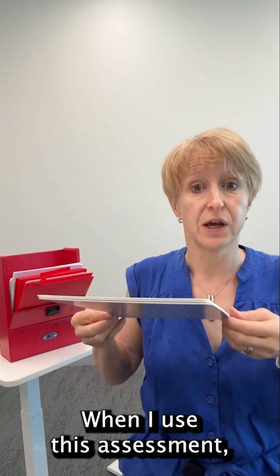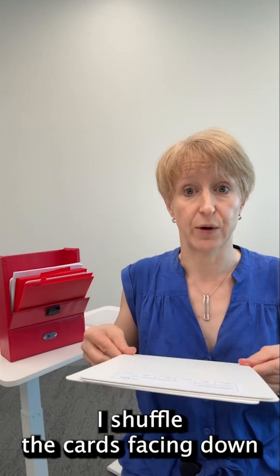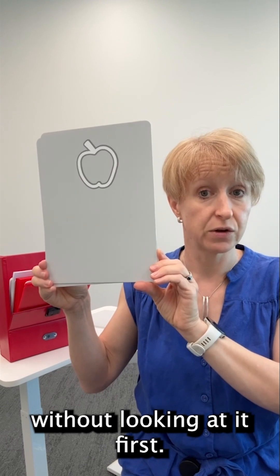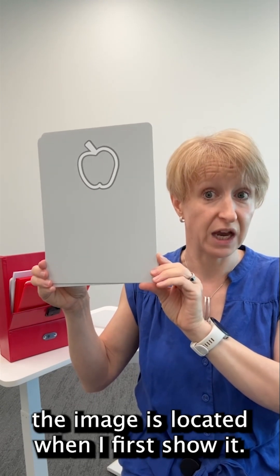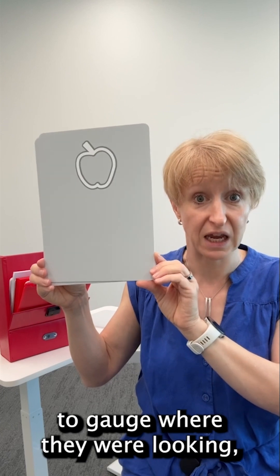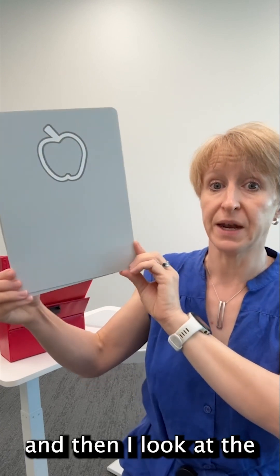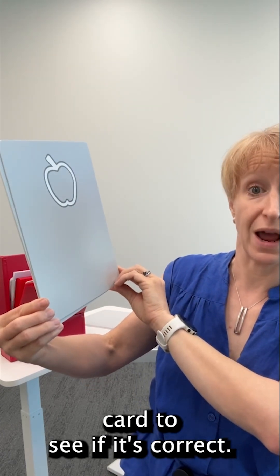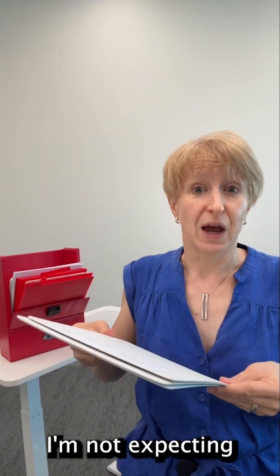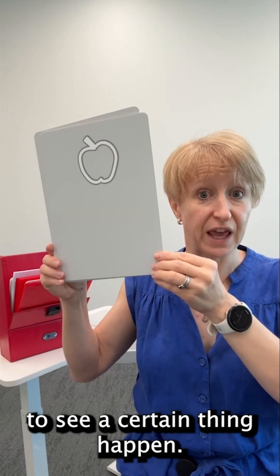When I use this assessment I shuffle the cards facing down and then present one without looking at it first, so I don't know where the image is located when I first show it. I have to use the person's eye gaze to gauge where they were looking and then I look at the card to see if it's correct. This helps to make it more accurate because I'm not expecting to see a certain thing happen.